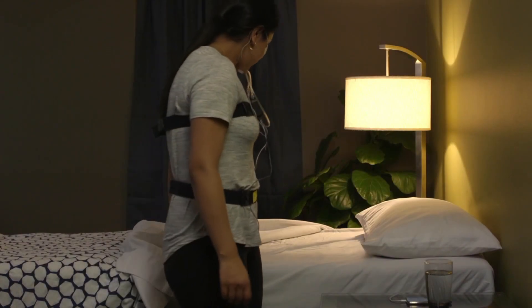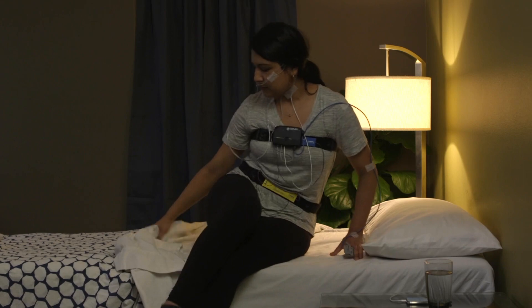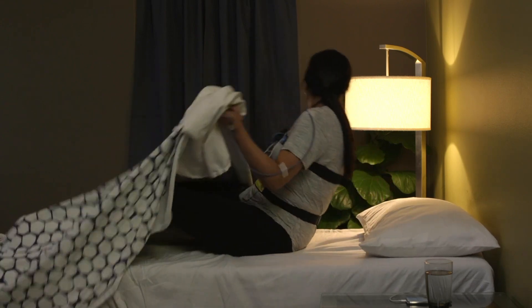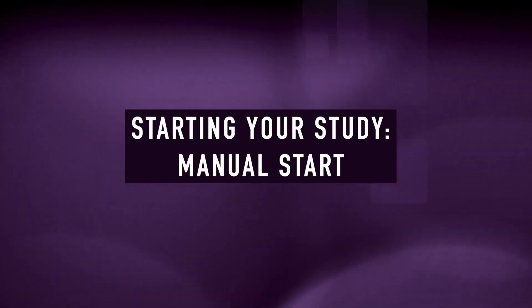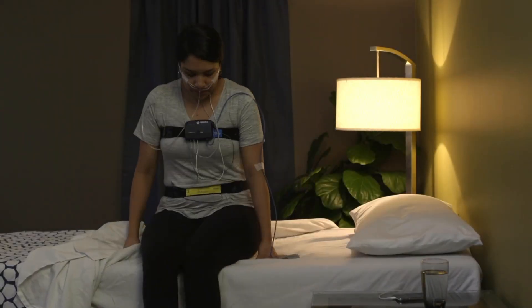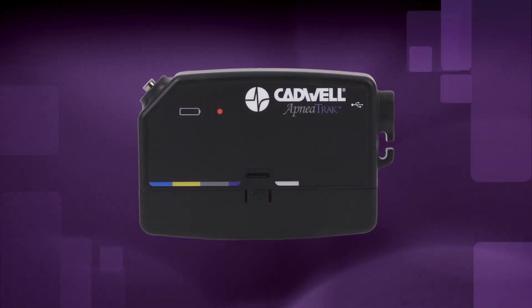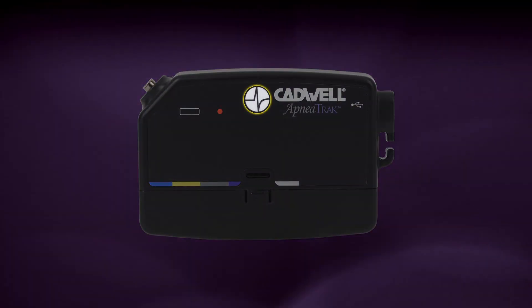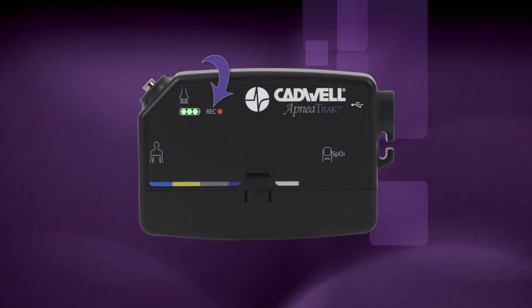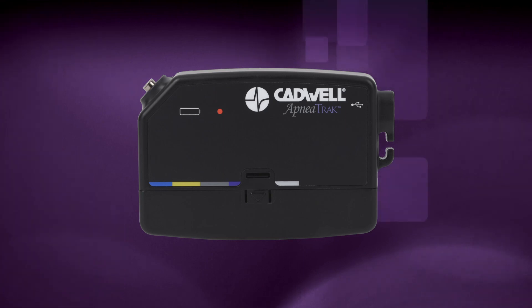If your provider set an auto start time, you don't need to do anything to start the recording. Just go to bed and the device will start at the correct time. If your provider instructed you to hold the button to start the recording, press and hold the raised Cadwell logo event button for three seconds until the recording REC indicator LED on the apnea track appears. The LEDs will then turn off, but the recording has been activated.